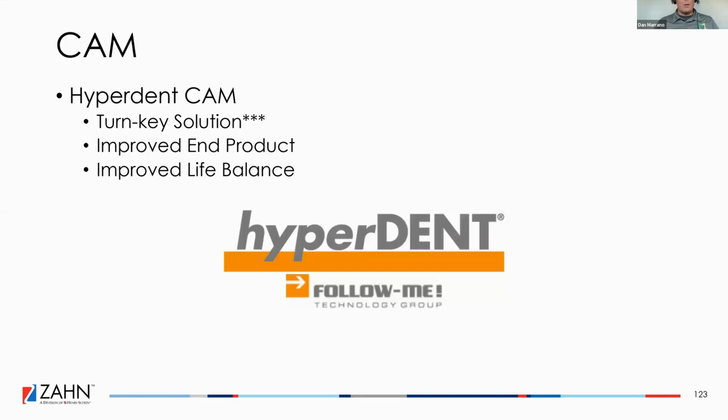And for me, it was an improved life balance. I was spending so much time calculating these jobs in other CAM systems and running simulations and recalculating and running simulations. And by the time I was done, there was one time early on before a lot of these strategies were available in tooling that I spent the entire day calculating a bridge before I would get to hit play on it. So that is really important to me, and that is why we have this specifically for our all-in-X restorations.